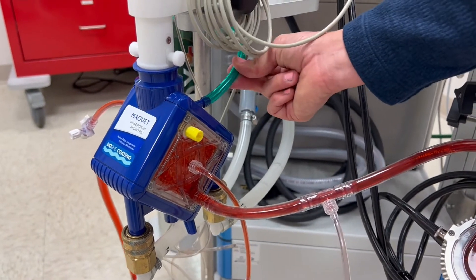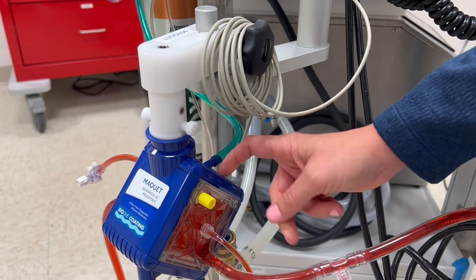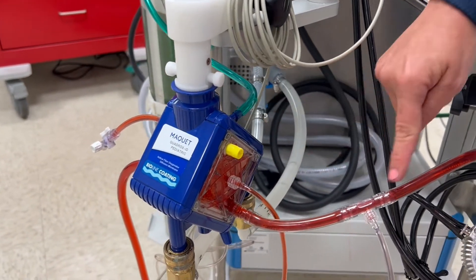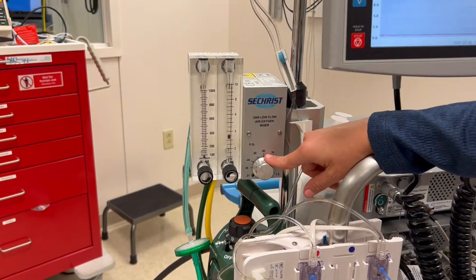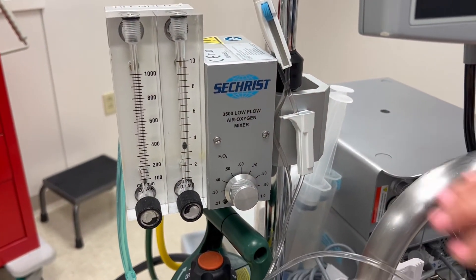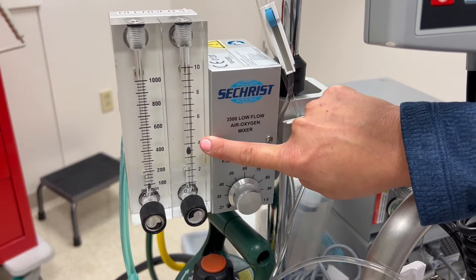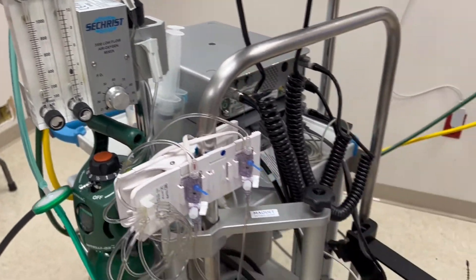On the back of the oxygenator, you'll always see a green line, and this is where our oxygenation is provided through the oxygenator to fully oxygenate the blood entering it. Up here you'll see the Seacrest blender along with our sweep gas. This allows us to set a percentage of oxygen and a sweep rate, sweeping CO2 out to provide highly oxygenated blood back to the patient.